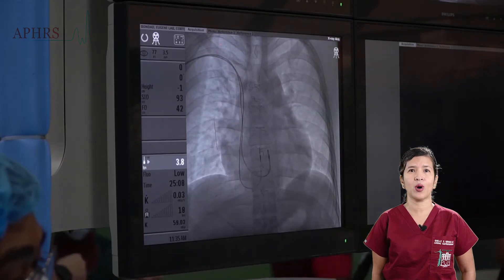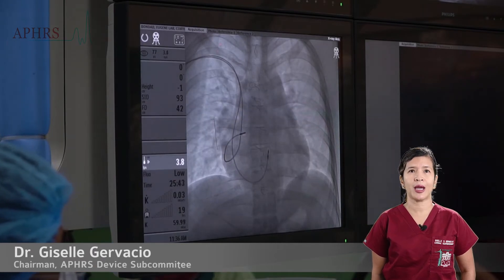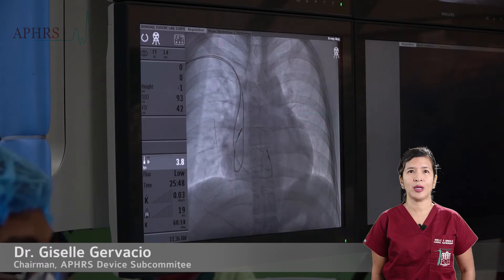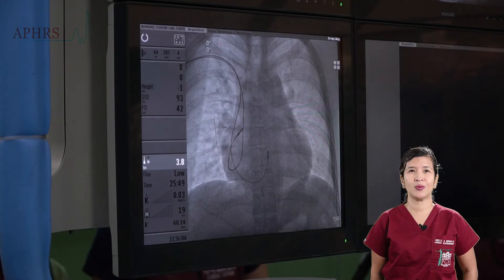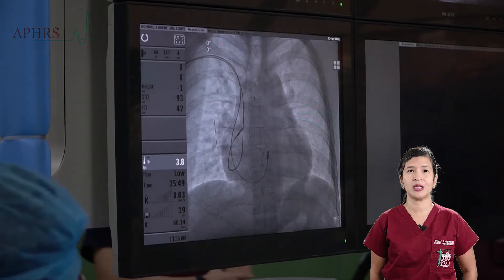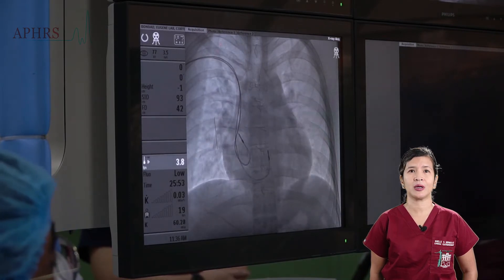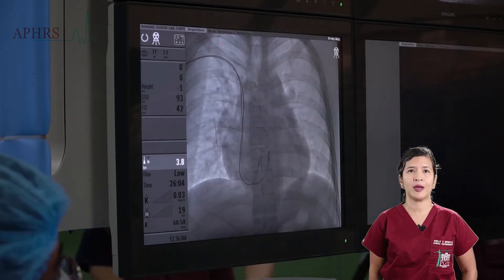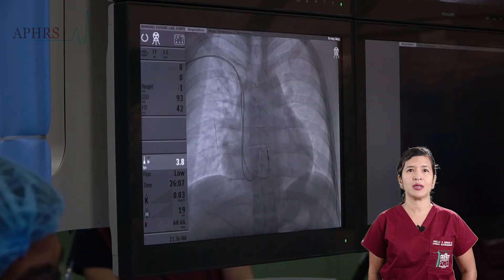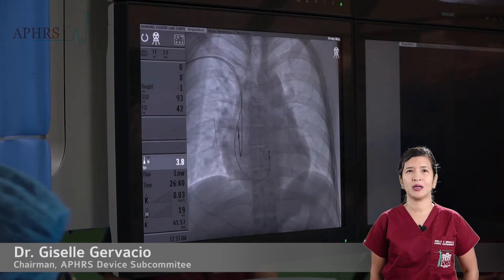Commonly, the RA lead tip will want to go towards the tricuspid valve, and so torque must be applied to the stylet to bring it away from the tricuspid valve. Some balancing is required because as torque is applied, there is a tendency for the lead to swing back and forth until it is finally stabilized and pops into the RA appendage. Efforts continue to swing the lead until it finally pops with one swing into the RA appendage.